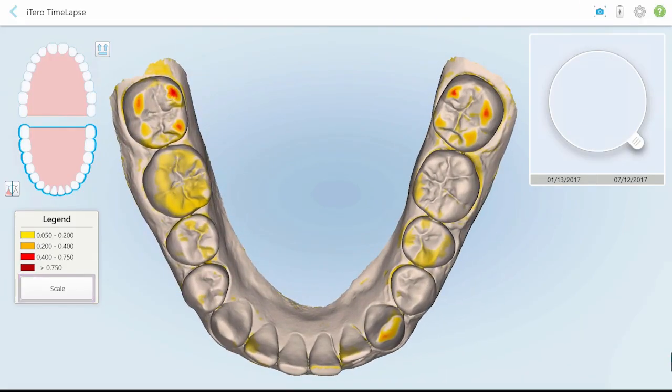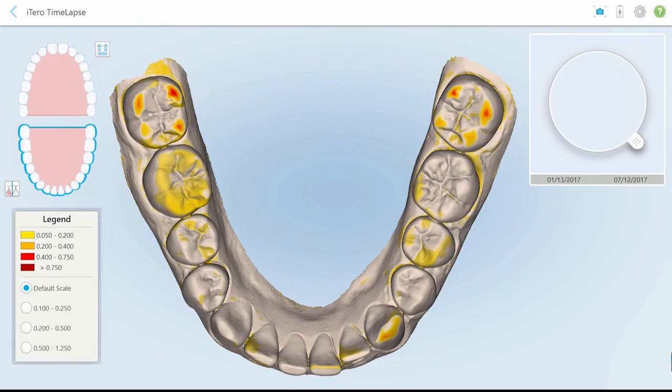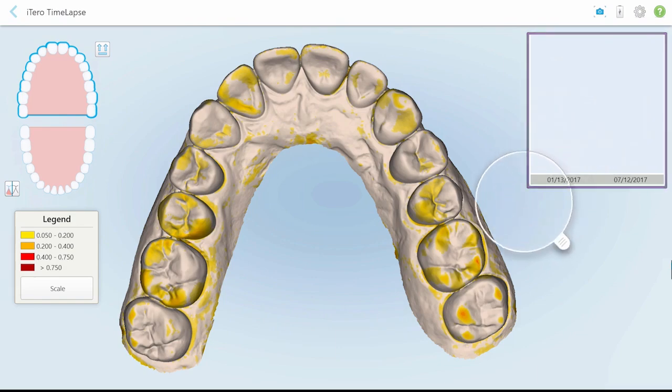For example, observe the gingival recession on these premolars. To optimize use of the animation window, tap Scale and adjust the measurements to view the amount of detail required. Drag the magnifying glass to an area of interest.